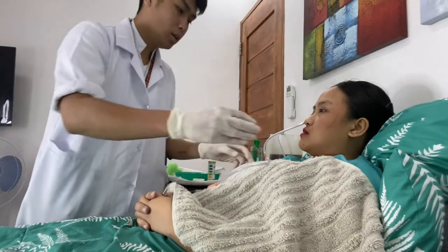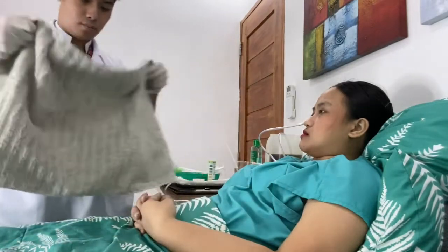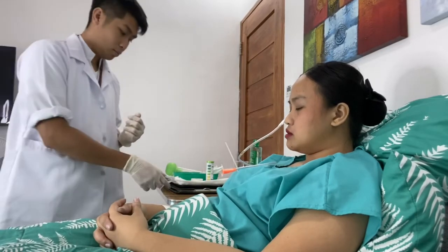Ma'am, I'm gonna remove the towel, okay? Okay. Evaluation. Evaluate the patient's response to the procedure. Document the procedure and other important data on the client's chart. Ma'am, I'll just secure the tube onto your gown, okay? Okay.